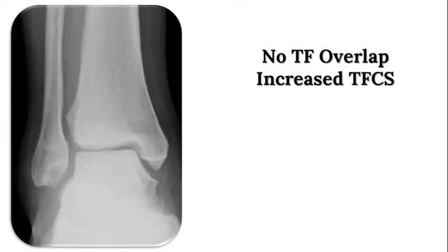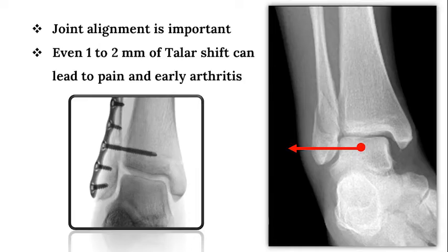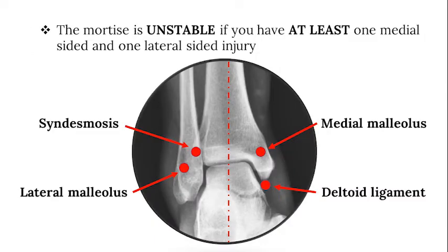This radiograph demonstrates a lack of tibiofibular overlap and a significant increase in tibiofibular clear space, which is consistent with a syndesmotic injury. Malalignment of the ankle joint predisposes to pain and arthritis. Even one to two millimeters of abnormal talar shift significantly changes the contact pressures and areas on the joint, leading to early arthritis. Deciding which treatment is best for the patient is dependent on an understanding of stability of the ankle joint.